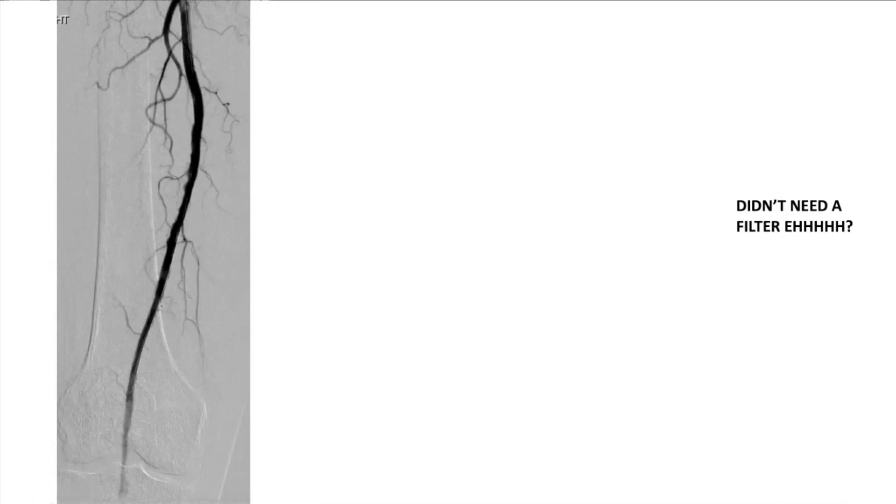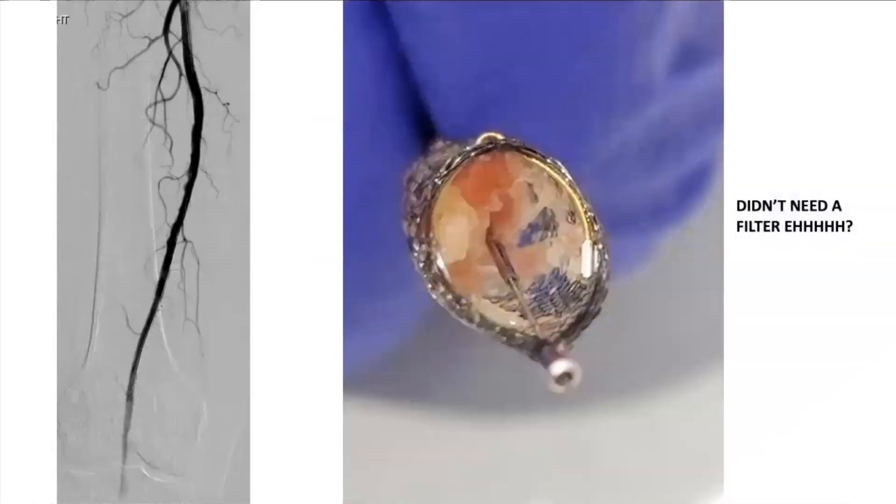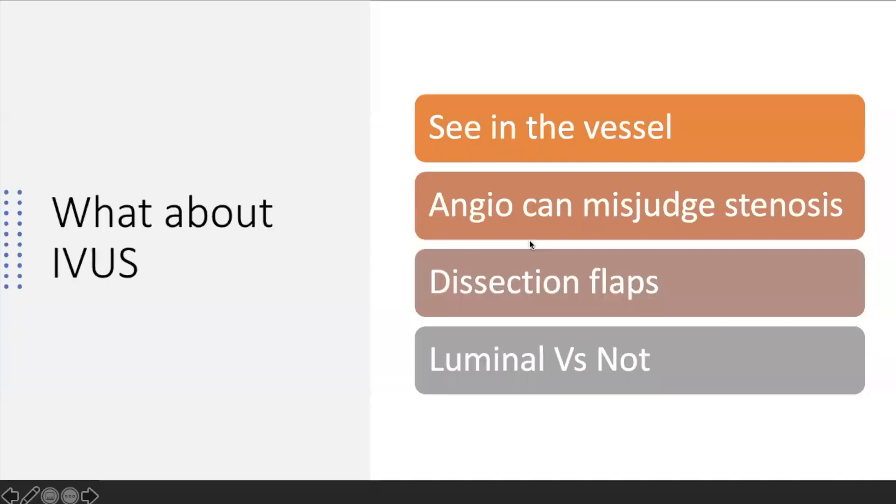When they tell you that you don't need a filter, this is that same patient after laser — look at all the debris that would have gone down into the popliteal and tibials. The worst thing you can ever do is turn a claudicant into a CLI patient. For me this is critical. Any time I'm going to do atherectomy, I'm almost always going to use a filter.